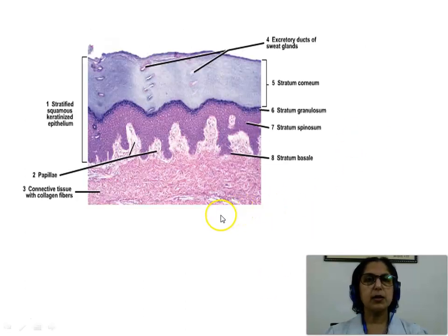What we see here is a picture showing us the epidermis of skin. This entire thing is the epithelium. The basal lamina, basal layer or the deepest layer resting on the basal lamina, made up of cuboidal or low columnar cells. The middle layer of cells which are polymorphous, and then comes the surface cells which are flat squamous dead cells because they do not have any nuclei.